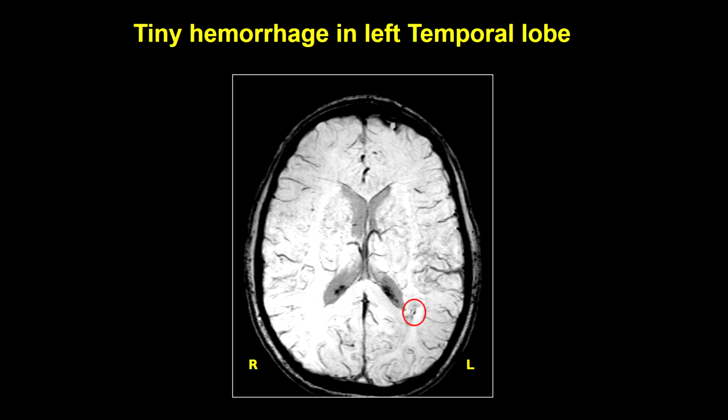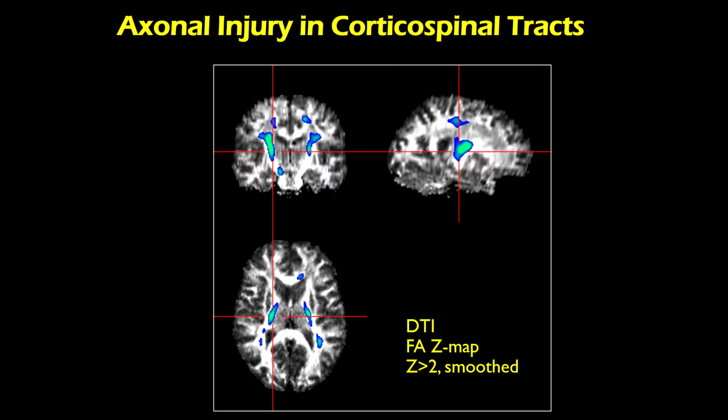She was somebody who stuttered, and she also had some mild language deficit, so we found that that was a nice correlation. We looked at her DTI, and we saw something we didn't expect, but now we've come to expect this in rear-end collisions.